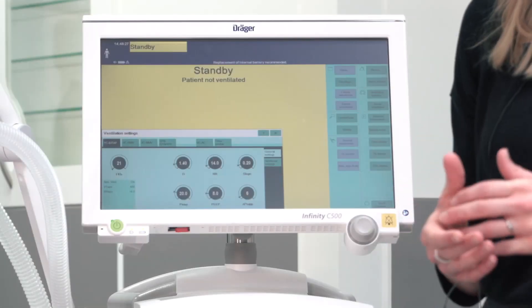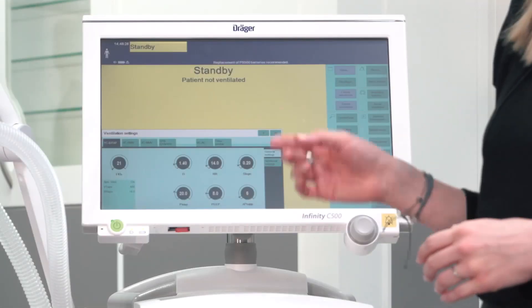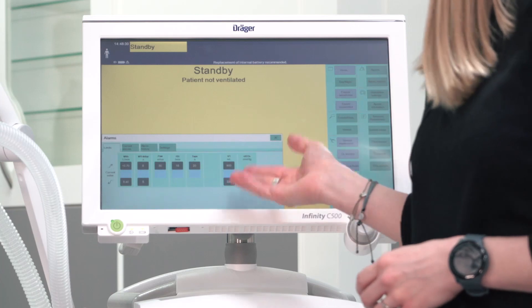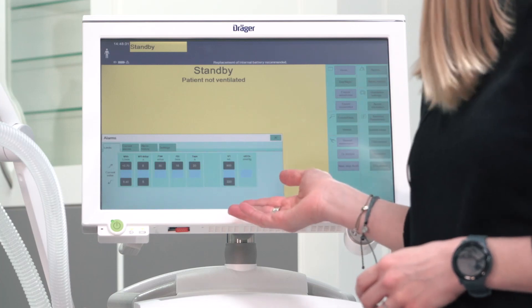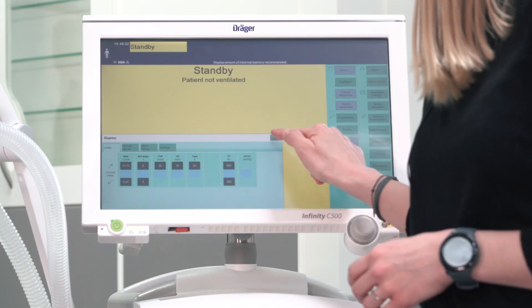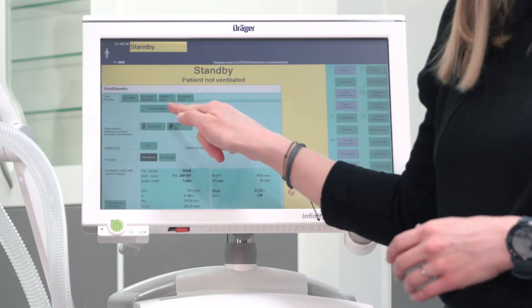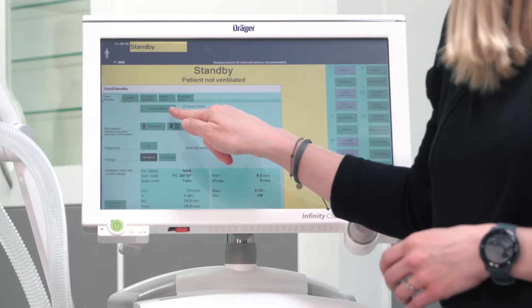Make sure that the alarm settings are appropriate for your patient and adjust if necessary. Afterwards, we can start ventilation.